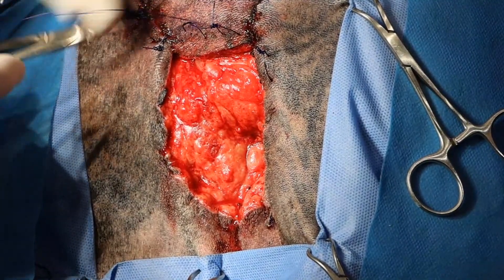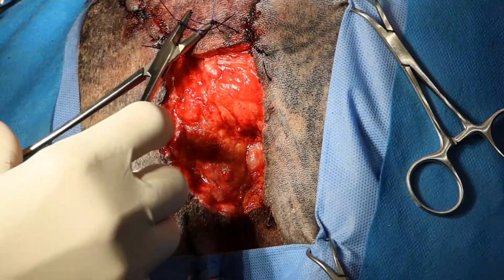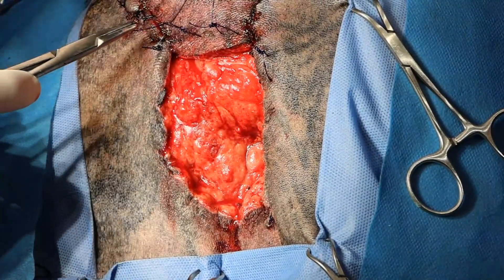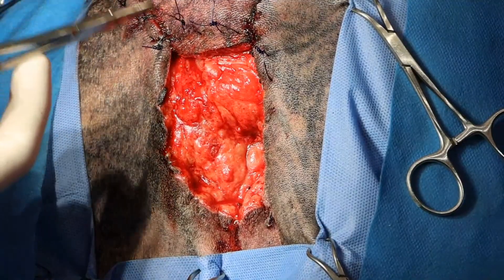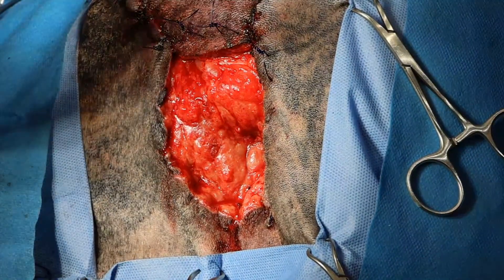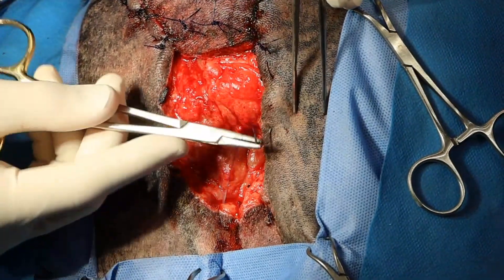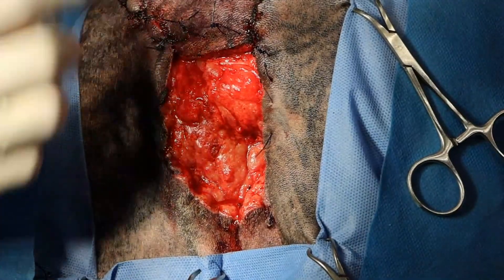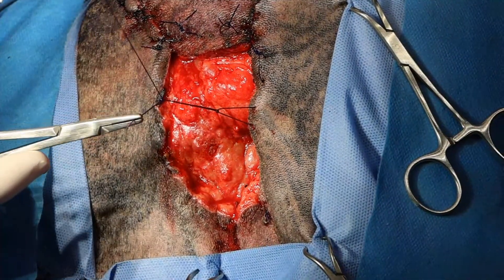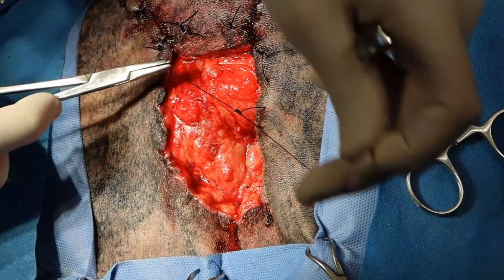And this will make huge strides in healing, probably in about three weeks. The key to putting loose tie-over sutures is to keep tension up like this as you pull it tight, and then put your throws on top.